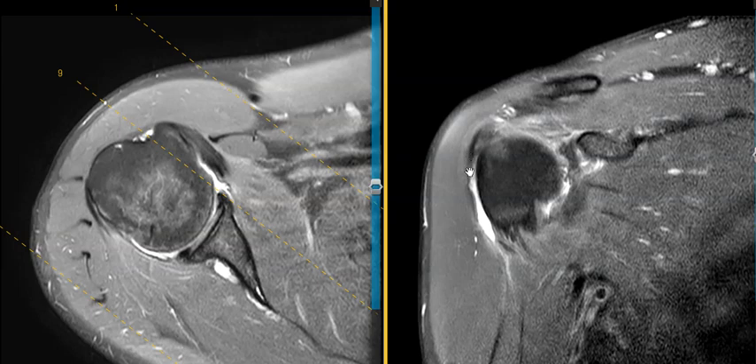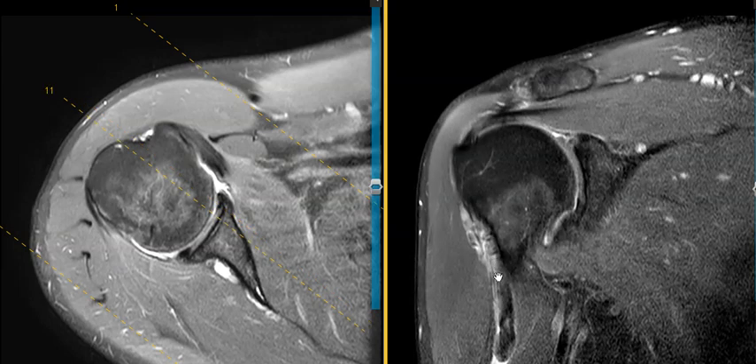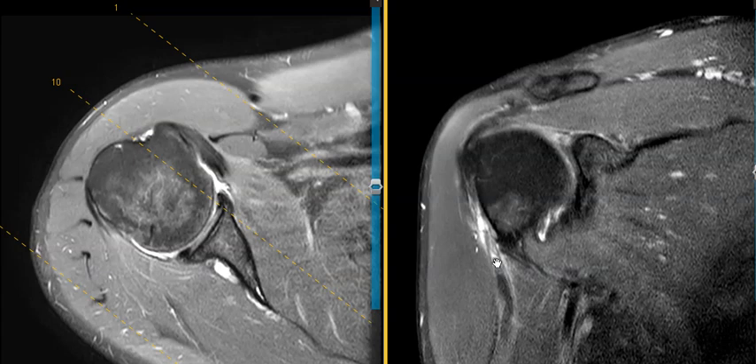Down in here is the bicipital groove area. We see fluid, which is white, instead of that nice dark biceps tendon. As we come down here we start to see something — this is the end of the biceps tendon, which is torn and retracted and has recoiled on itself. This wavy contour is the biceps tendon recoiled upon itself, just below the bicipital groove.